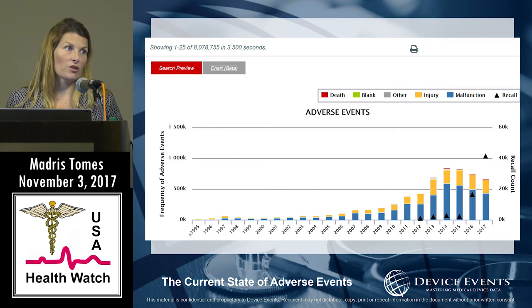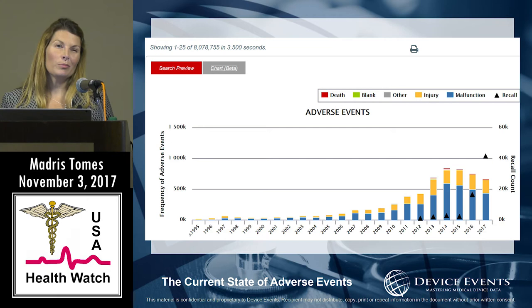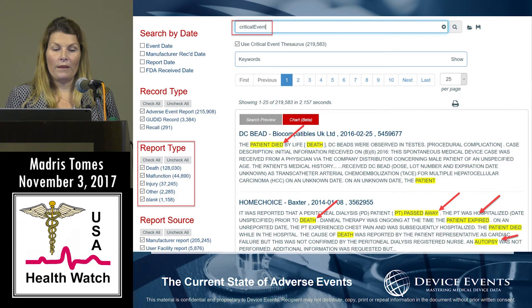So the FDA even doesn't use the adverse events like they should. For a long time, they were blamed and said the data's too hard to find or the data's too dirty. And so I've made it my mission to make the data usable. You can see this is essentially the baseline. Any number you see here is probably 4 to 5 times higher in reality because of underreporting. So if you see that there are 9,845 adverse events from physicians about these devices, that's a pretty decent number. And I'd hate to think that it's 5 times that, but it likely is.